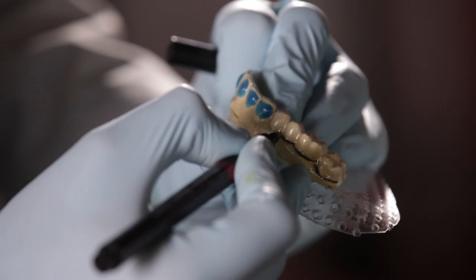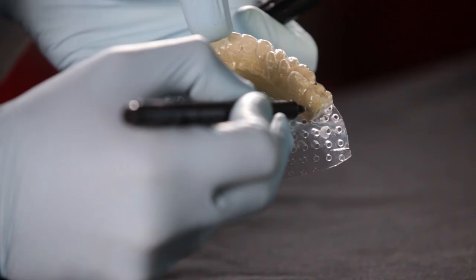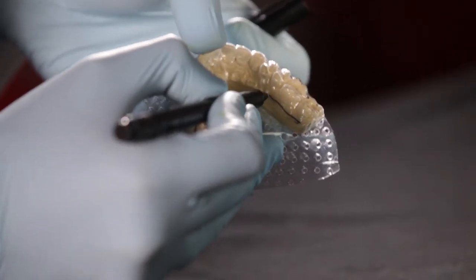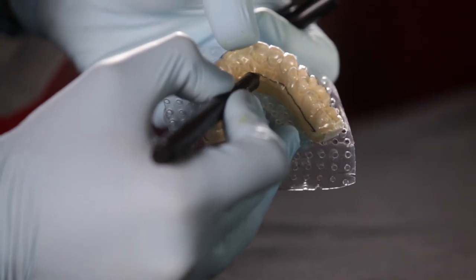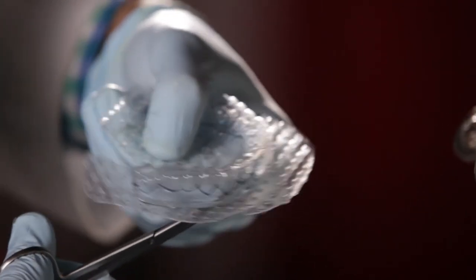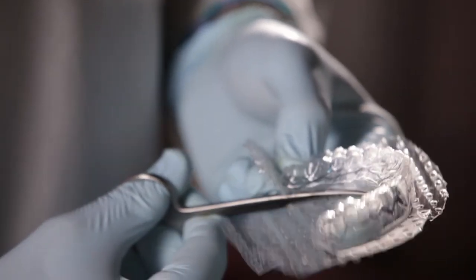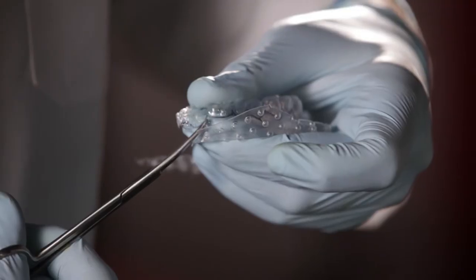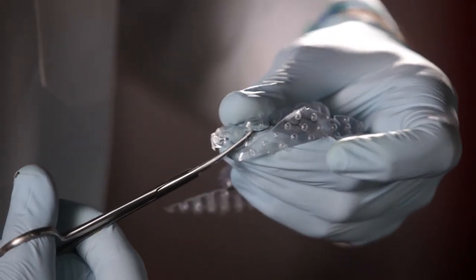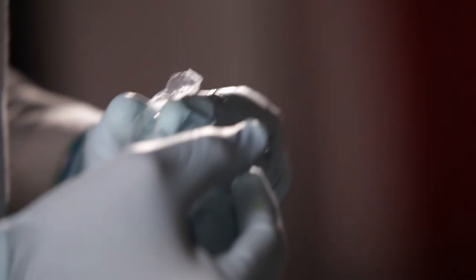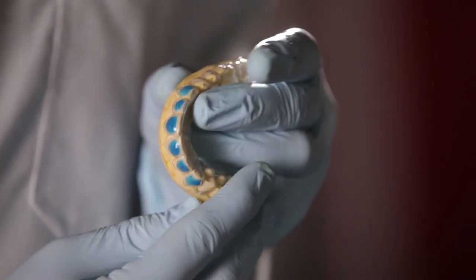Now I'll just take a marker and mark the gingival margins on the facial aspect. This is going to be a reference when I'm cutting the tray. On the palatal side, you can cut the tray along a straight line. Cut it along the markings with a sharp pair of curved scissors. We now evaluate the tray for any rough edges and perfect fit.